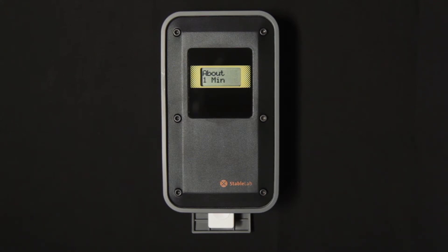Once the cartridge is complete, the reader will automatically read it and give you a result. That result stays up on the screen for 20 seconds, and then the reader powers down to conserve battery.